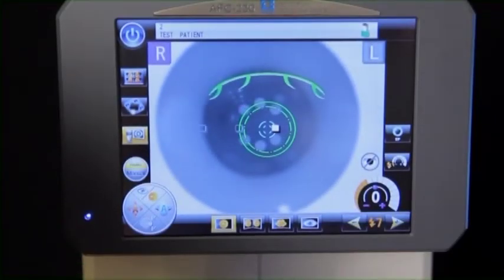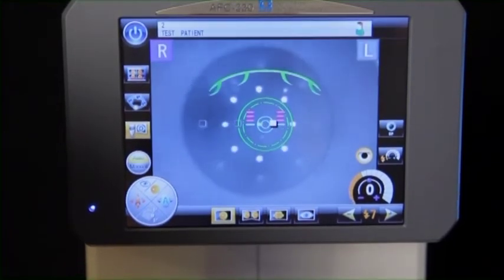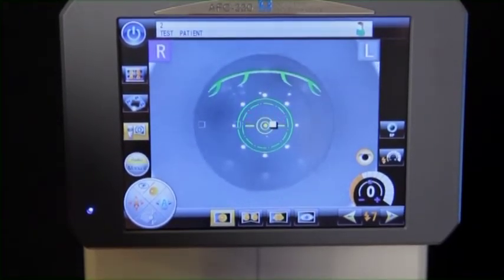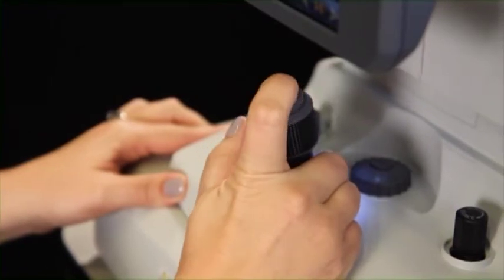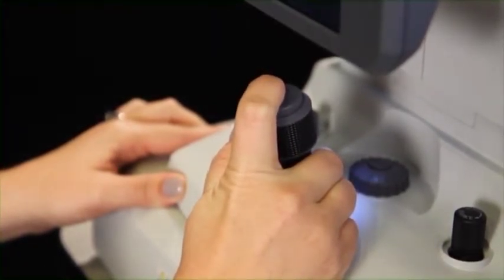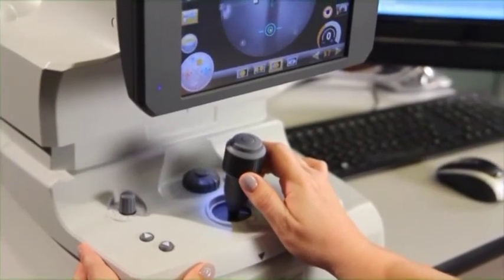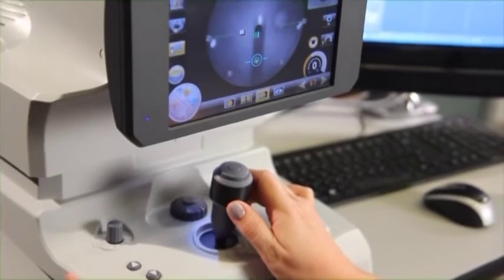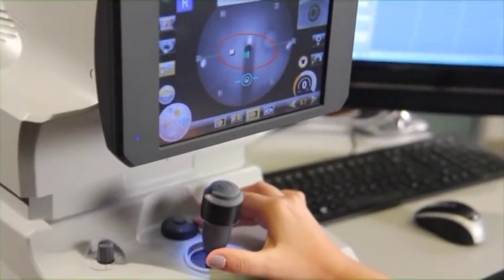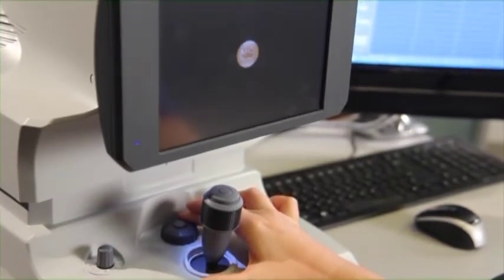Occasionally, the camera will indicate there's a deviation in focus. The amount of focus deviation is displayed on the center of the focusing rod with green or purple lines. The operator has the option to press the capture button on the joystick and capture, or use the fine focus. Green and purple lines will indicate how much to turn the fine focus wheel. Turn the wheel until the green or purple lines become one. After adjustment, the camera will automatically capture.